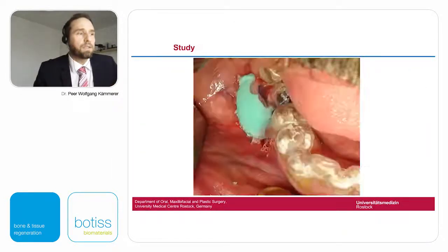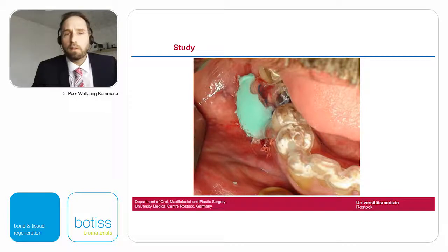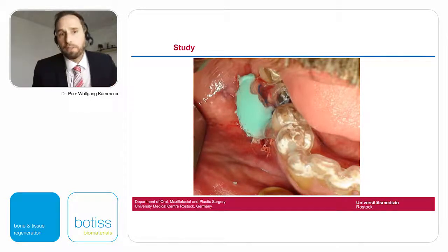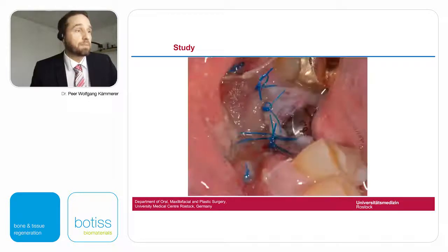The next thing we do is using this wound coverage we prepared before. It's just a silicone material to fix it. The splint is removed once a day for cleaning, then put back. We had some cases without splint. It works perfectly well without splint if you use the correct sutures. But most of the patients feel quite better when having this splint just for protection.